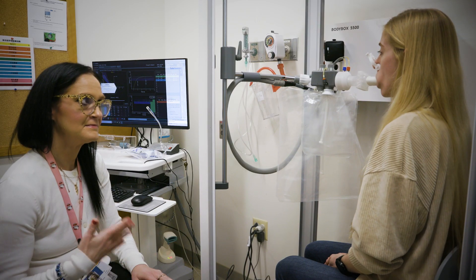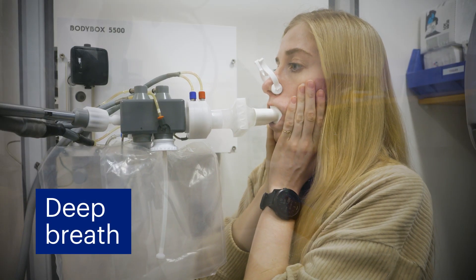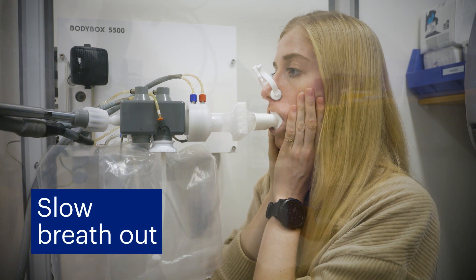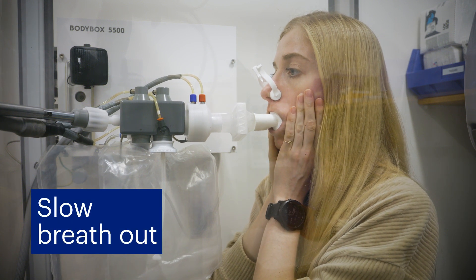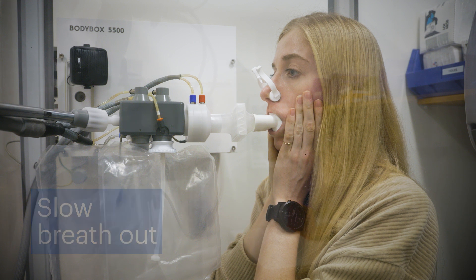After a few seconds, we will tell you to return to normal breathing. Then, breathe in all the way, filling your lungs completely, and then breathe out slowly until there's no more air left in your lungs. You will need to continue breathing out until you're asked to stop, even if it feels like you have no more air left.